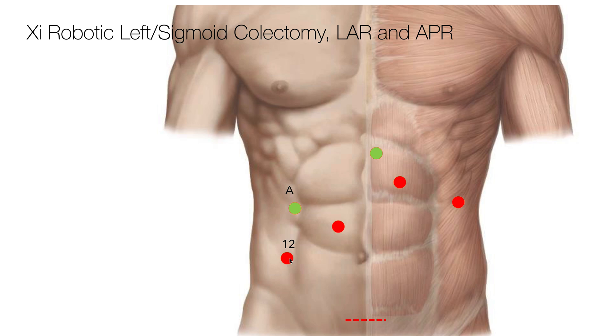I then place a 12 millimeter trocar on the right hand side. I find the anterior superior iliac spine and come up several centimeters from that, and also avoid the semi-lunar line, since there's a higher rate of hernias if the trocar goes through there.